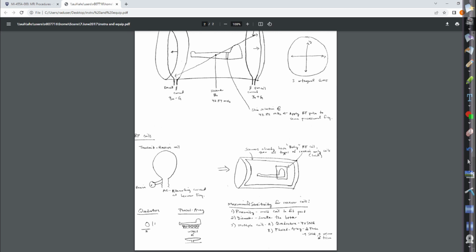And then these are just some reminders about our coils that are receiving the signal. Some coils are referred to as transmit and receive coils, where with a head coil, if you want to transmit and receive, you can, and then you don't have to activate the body coil inside the scanner. That's great for any time you have some kind of conditional device.